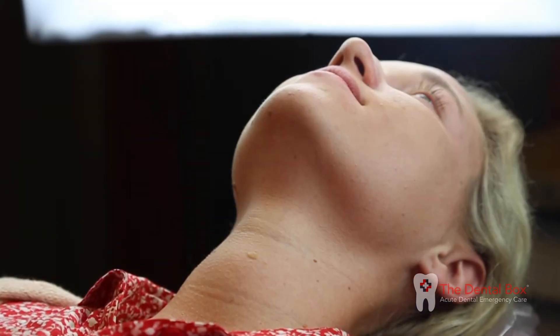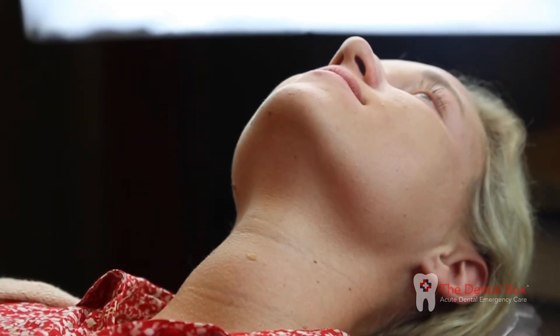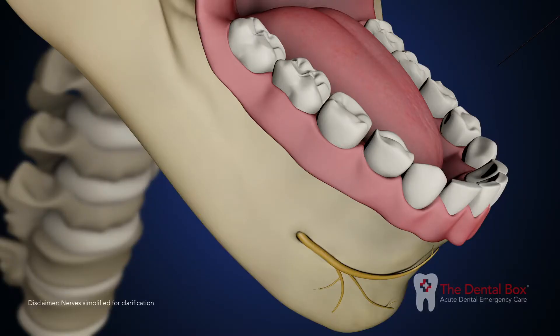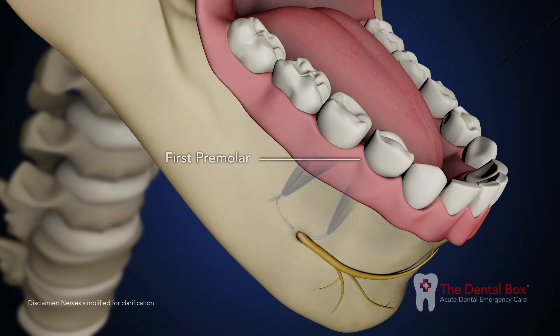Position patient supine if possible. Locate the mental foramen, typically between the apexes of the first and second premolars.